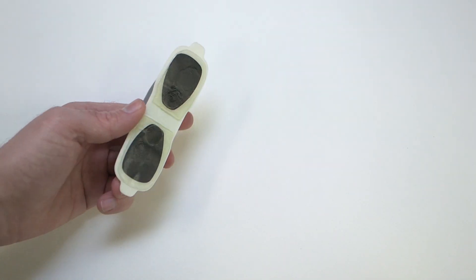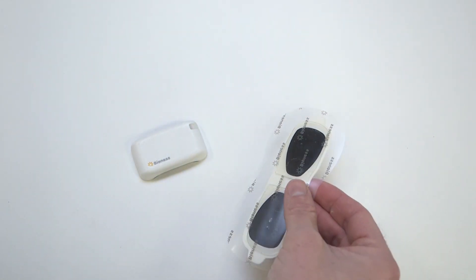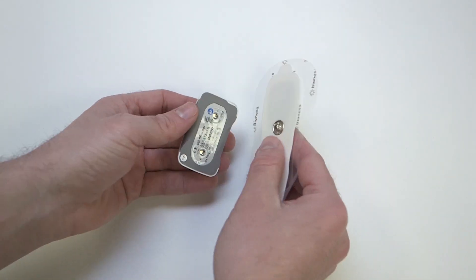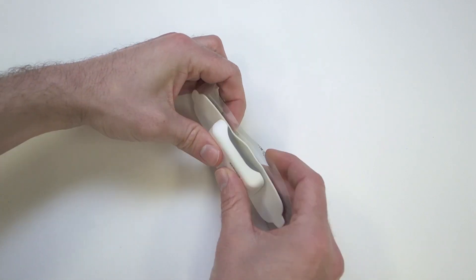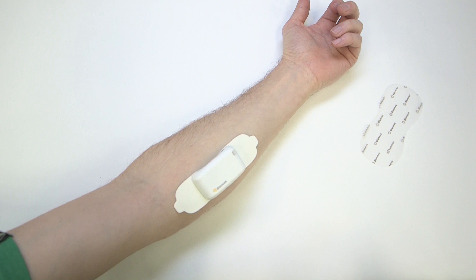Discard the worn or damaged electrode patch and begin with a new one as needed. Make sure that the EPT is securely fastened to both snaps of the electrode patch. The gel on the electrode patch should have direct full surface contact with bare skin.